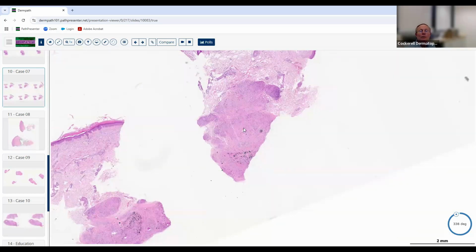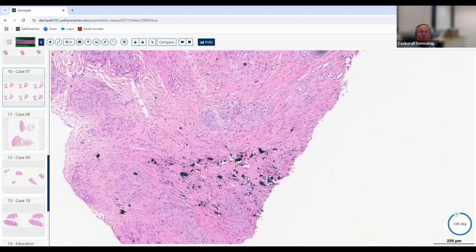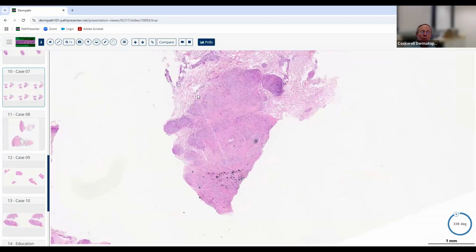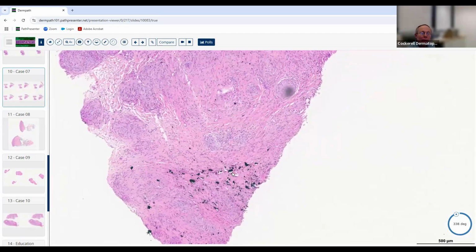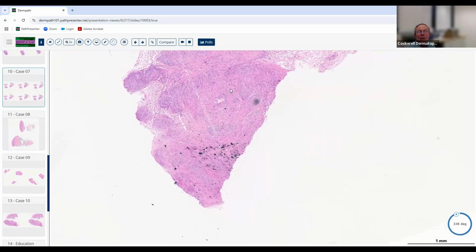There are 2 things I want you to see in this focus here. Number one, there's this black material, foreign material. This doesn't belong here. It's black. And then notice, do you see these little lines here? They're linear lines. Those are created by man. These are artifactual tears where the microtome blade is passed through the tissue and has taken this black material and ripped it right through. It's an artifact, but it's a sign of foreign material that's present in the skin, really in the plane of the tissue. This material is hard enough that a microtome razor blade tore it through the skin like this. So that's a clue that you're dealing with a foreign material. It's a helpful clue.